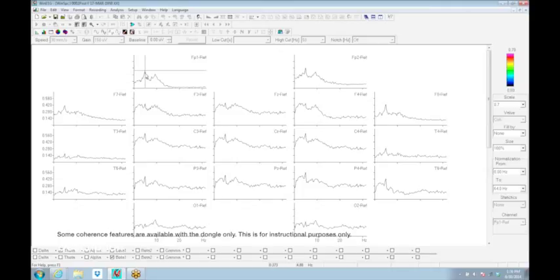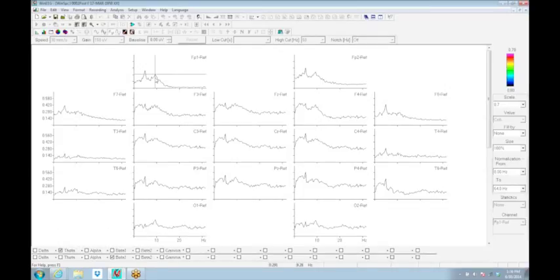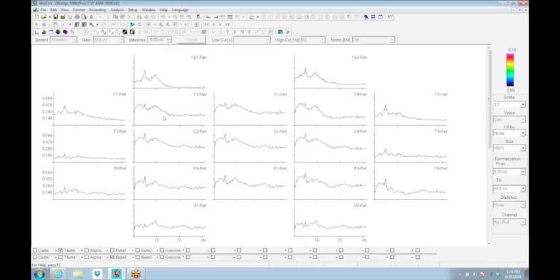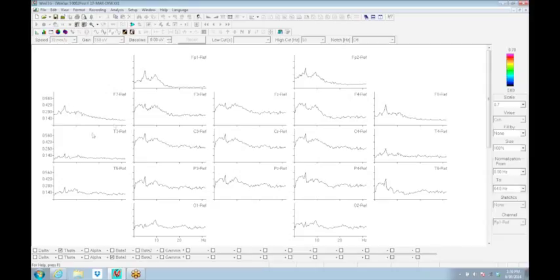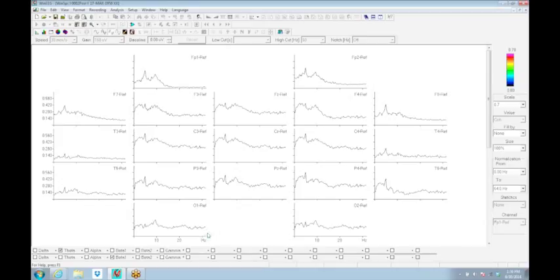This is raw coherence. It goes from zero to one. As a rule of thumb, coherences above 0.5 or below 0.1 tend to be outside of a normal range. Here we end up having coherences that are at 0.37. You can see the numbers down below. You put the crosshairs on. You read the numbers down below. This is that slower content. Here's the alpha at 0.291 coherence. These coherence ranges are within the normal functional range of raw coherence. Hyper coherence, you got to start to stick up above the 0.5 or so, and hypo coherence down below 0.1. In general, the coherences here are within a normal functional range. Not too hot, not too cold, just the normal amount of connectivity.